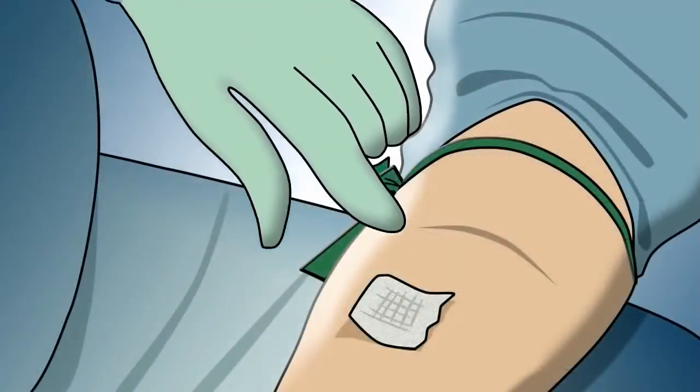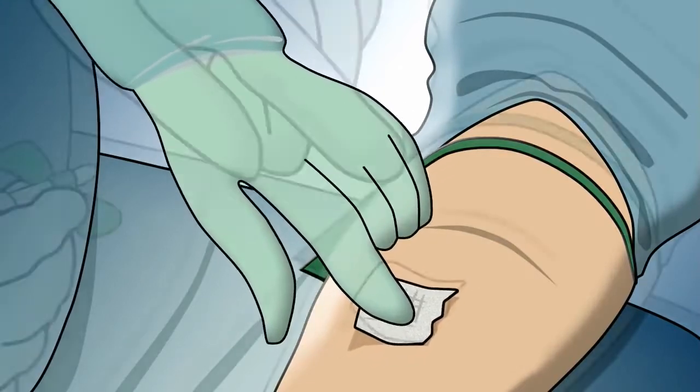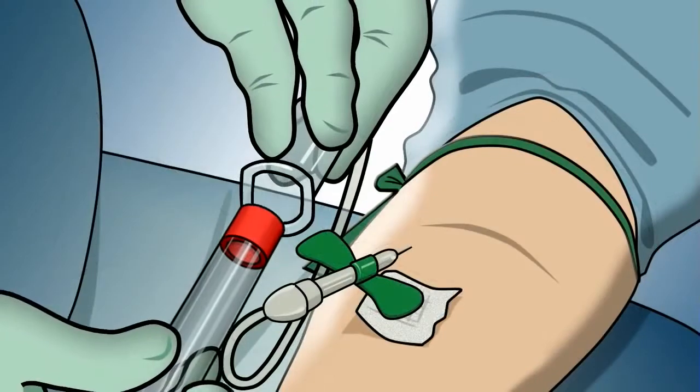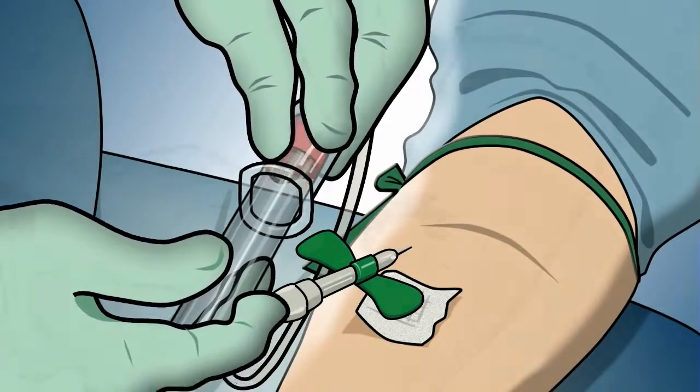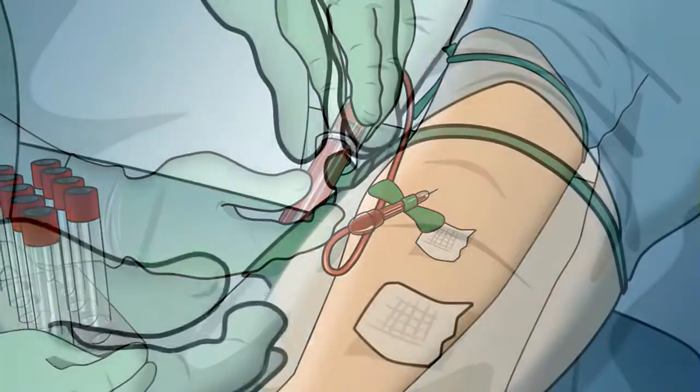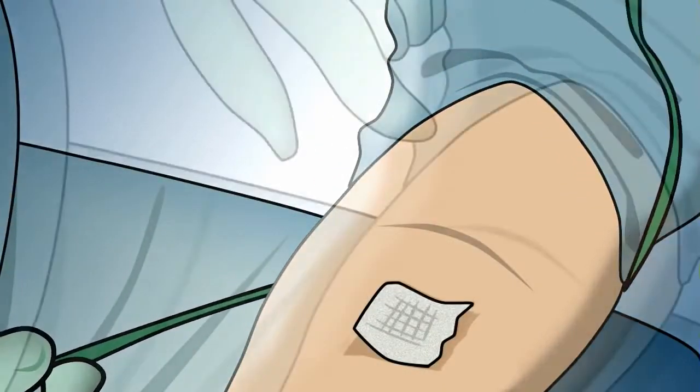Place the tourniquet and proceed with the disinfection of the skin. Insert the needle into the vein and the tube into the tubes tray connection, and wait until completely full. Remove the tourniquet and proceed with the disinfection.